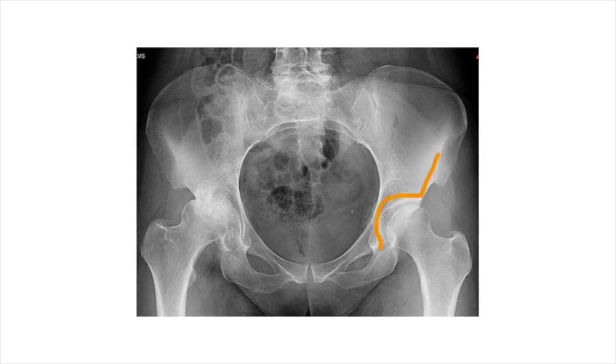On this side, here is the socket, and you can see an outline of the ball. There's a great space between the ball and the socket, and that space represents where the cartilage lives. This hip has lots of cartilage represented by the space, so that's a happy hip — it's moving smoothly.